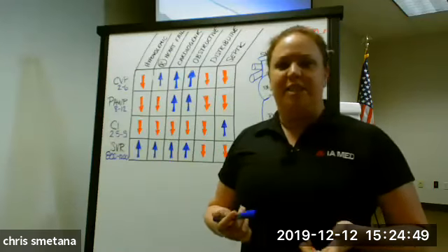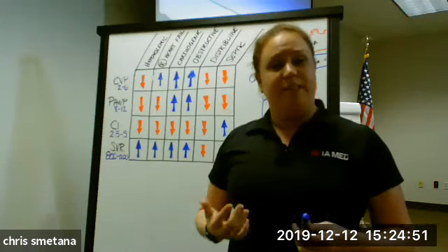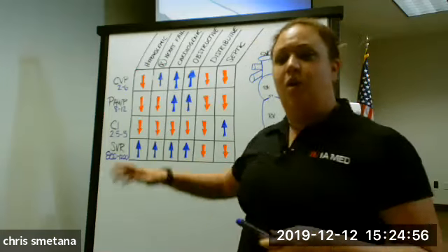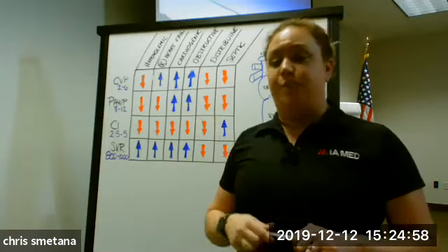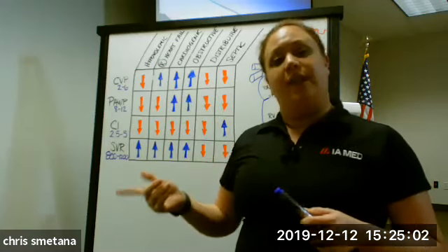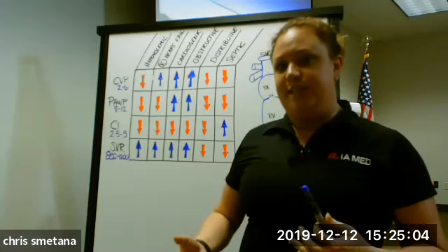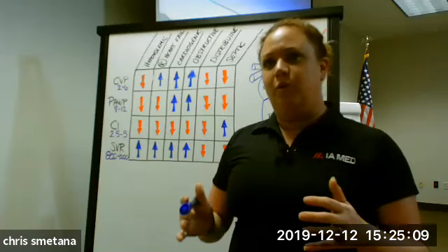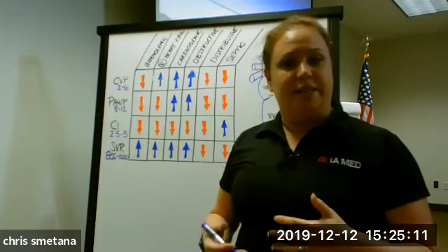When I'm going through and teaching hemodynamic monitoring, one of the things I found really, really challenging when I first started studying for my FPC was this stuff. And I found that especially on the FPC, I had a whole bunch of questions on this. The nice part is you typically get a decent amount of information along with the numbers that you can go through and figure out what's wrong with your patient.